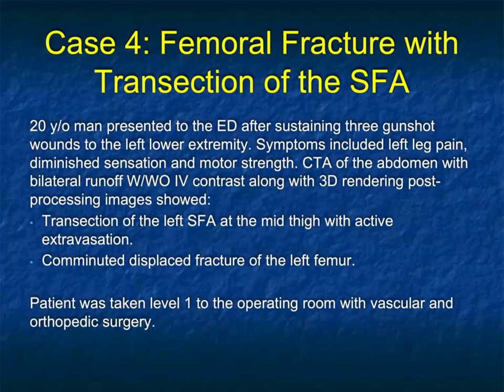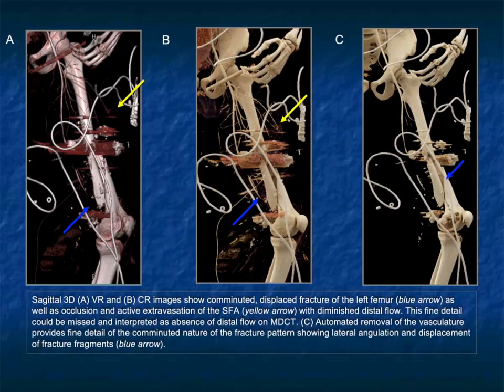Again, one of the important things we can't overemphasize, but all of you know this, is triage is everything. CT has changed trauma. And this is a 40-year-old story, of course. Whether it's liver, spleen, chest, aorta, musculoskeletal, CT is what determines, for the most part, when patients do or do not go to surgery.